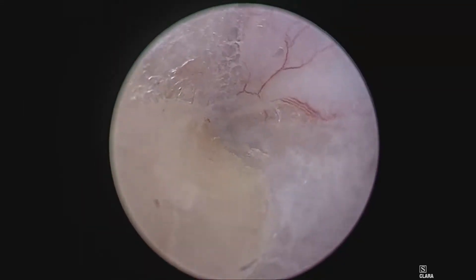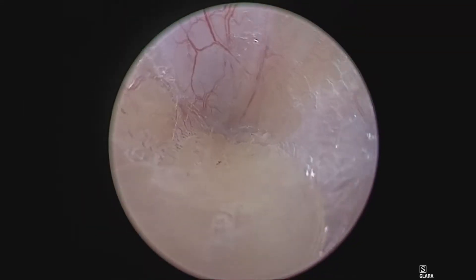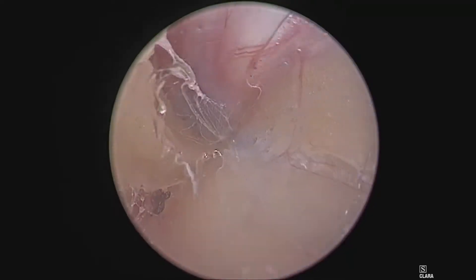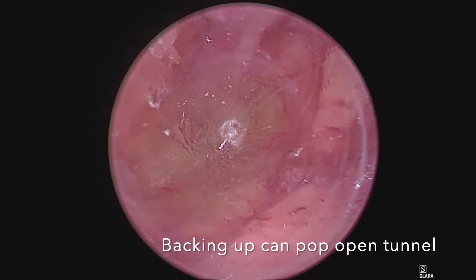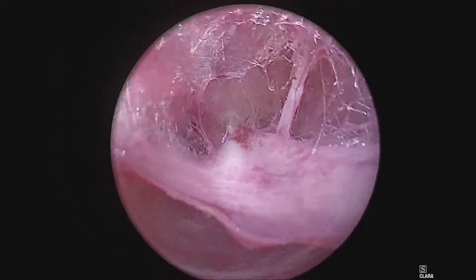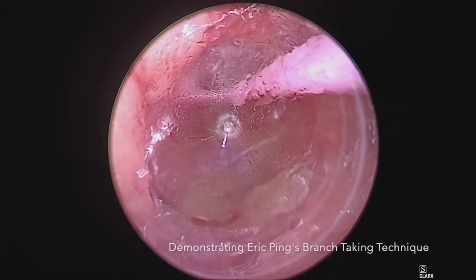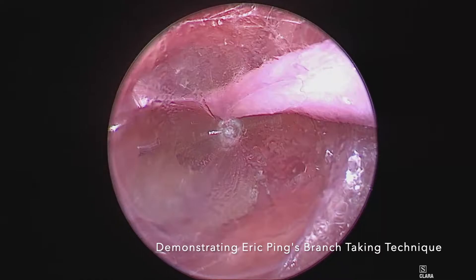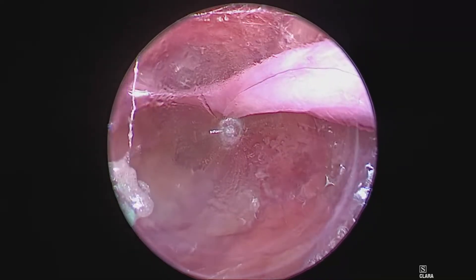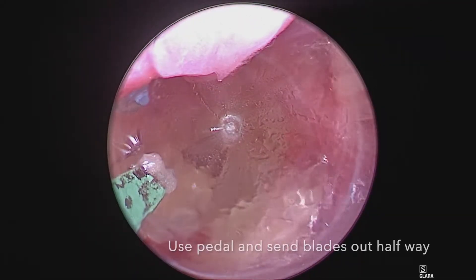Now I continue again right at 6 o'clock. There is no need to do any more dissection than this during the posterior pass. Notice how backing up pops open the tunnel. Now I want to demonstrate branch taking using Eric Ping's technique. Identify your branch, send your blades out about halfway, and using the foot pedal, close on the branch.